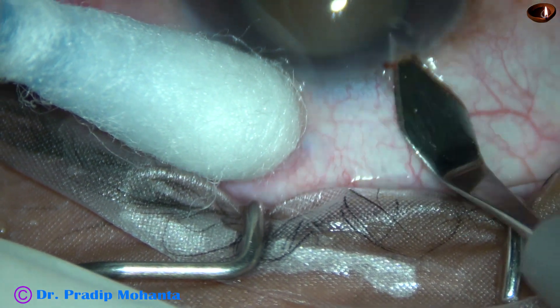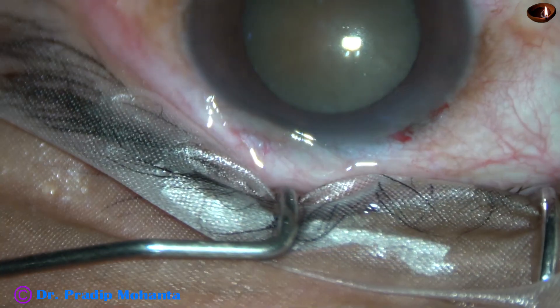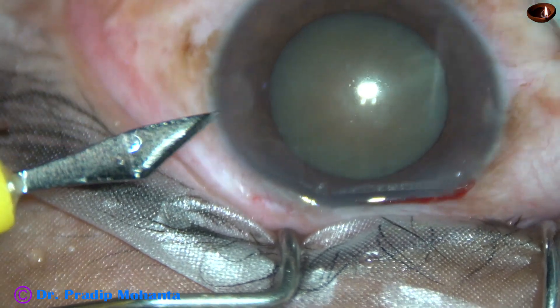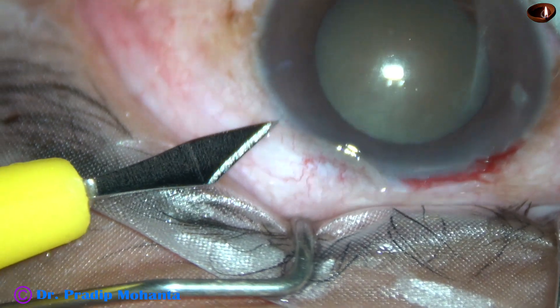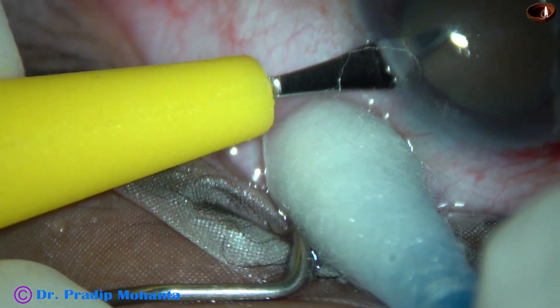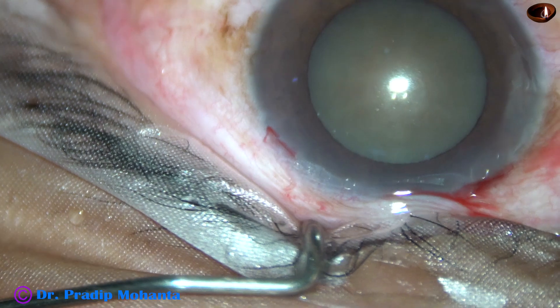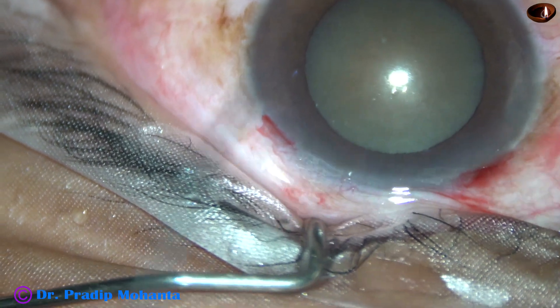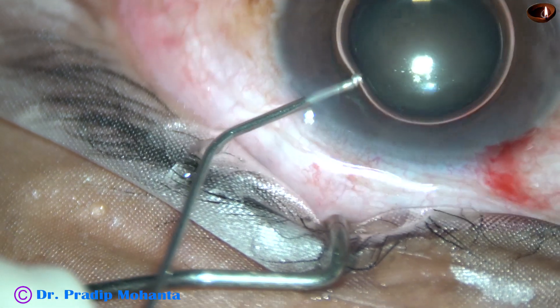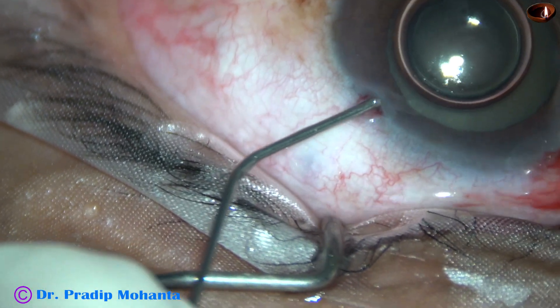This is a hard cataract. Nucleus sclerosis is about grade 5. Initially, the dilatation of the pupil is very good — about 7 or 8 mm at this moment. And I didn't expect any problem in this case, but see what happens as the surgery goes.